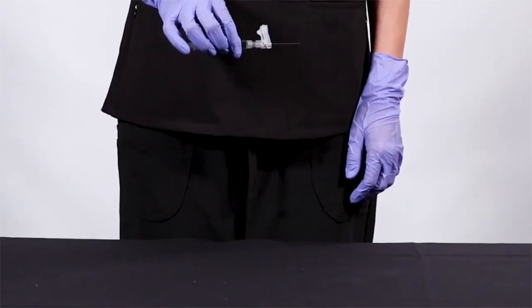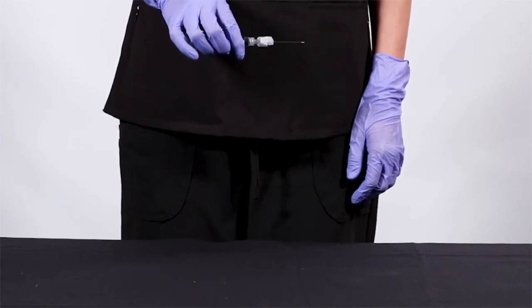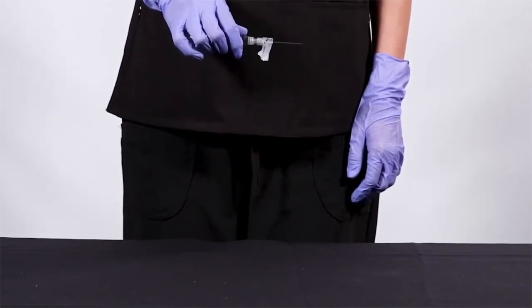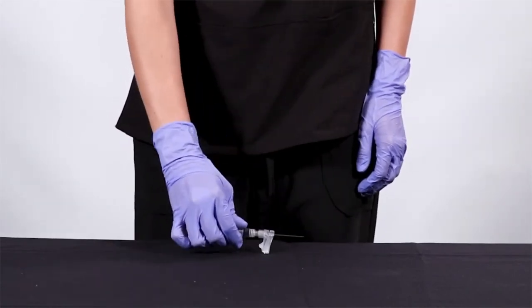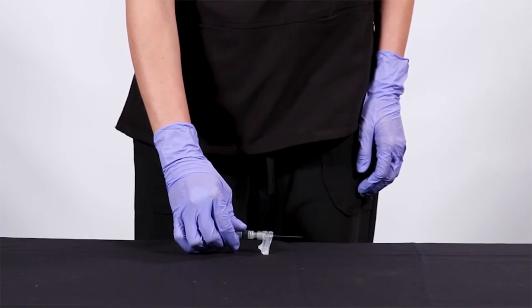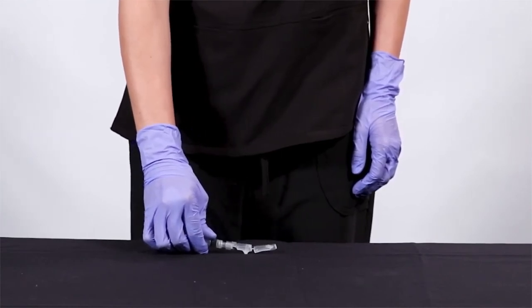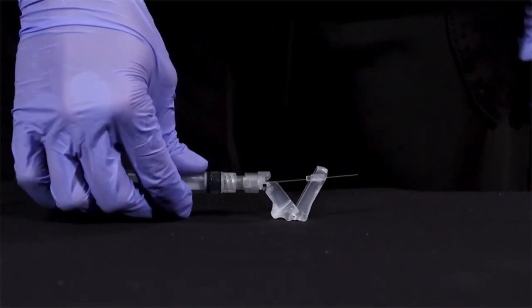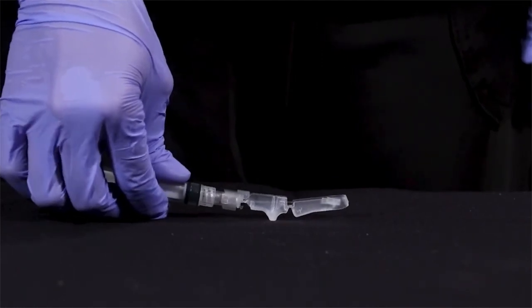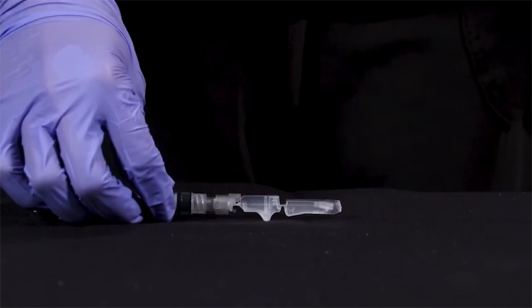To activate using a flat surface, simply turn the needle and syringe upside down. Using the same hand, place the safety shield against the flat surface. Gently push down and drive the syringe in a backwards motion until an audible and tactile click verifies that the safety device has been activated. Once the safety mechanism is in its fully extended and locked position, notice that the needle tip and cannula are fully encased.